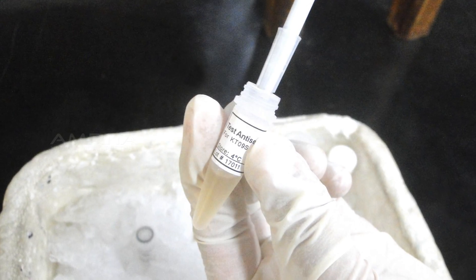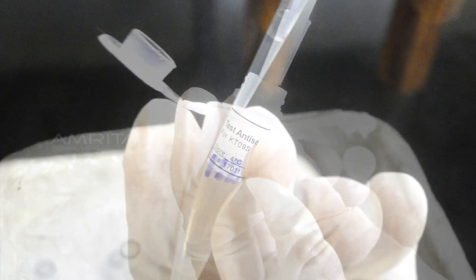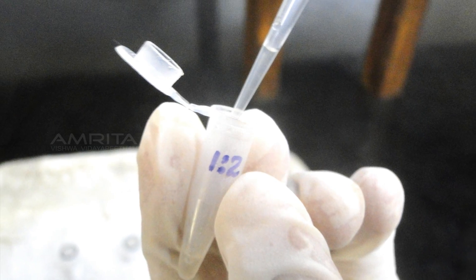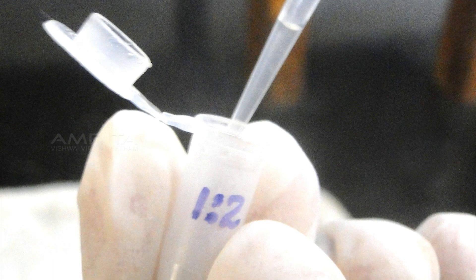Add 20 μL of test antiserum into the first vial and mix well. The dilution of antiserum in this vial is 1:2.